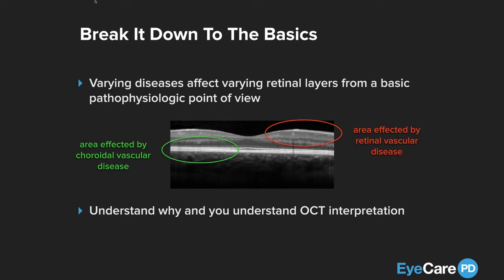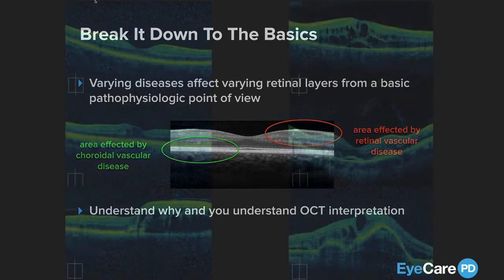And I'm going to spend the next few minutes helping you to understand the importance of this distinction, because it's not about just finding all the different layers and knowing which layer is swollen when, but rather there are certain patterns that you can use to determine very quickly what's the diagnosis and what's the best treatment.